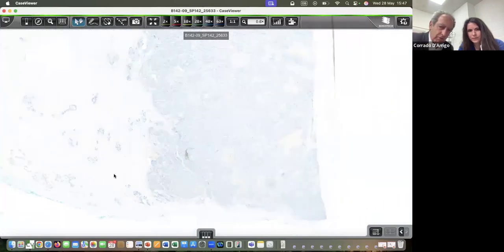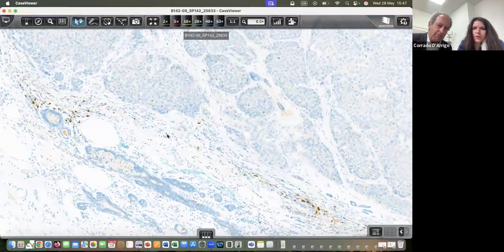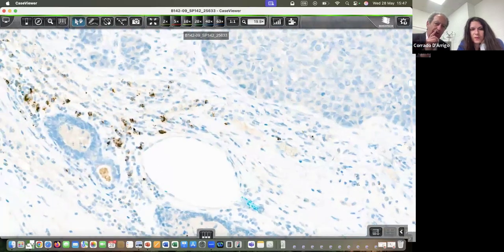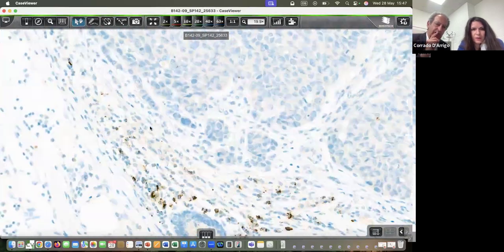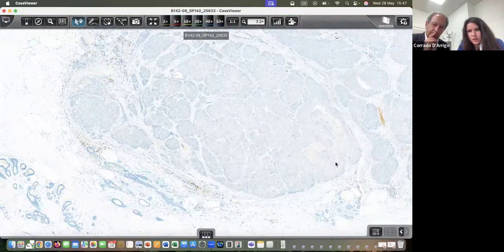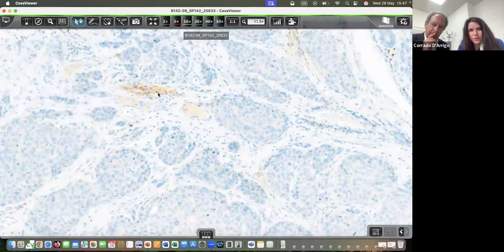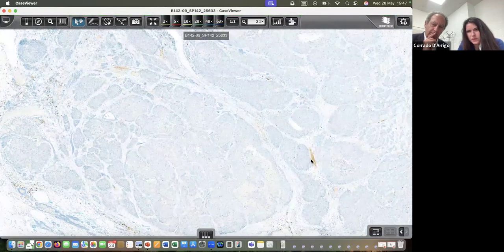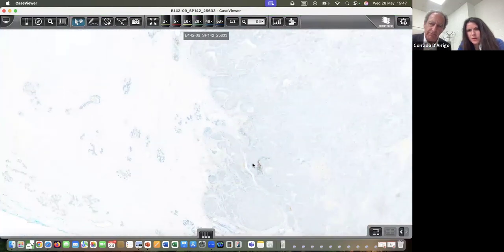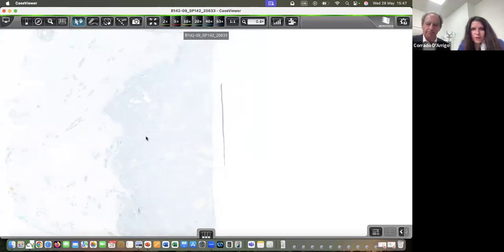I was also going to ask you, there is this staining here at the periphery. Is this pigment or is it real staining? Because that's the only thing you need to be wary of. I think it's dark enough. Yeah, it's real staining, fine enough. It would be nice if we had an example of what is not real, of course. It is associated with probably necrosis or intravascular. Okay, so how would you tackle this case then?